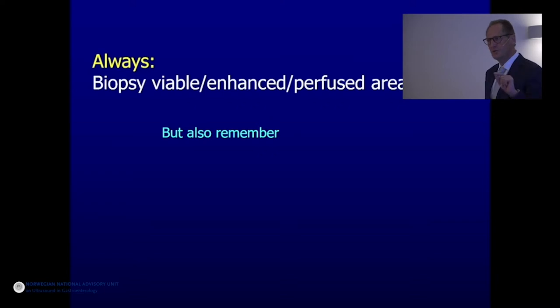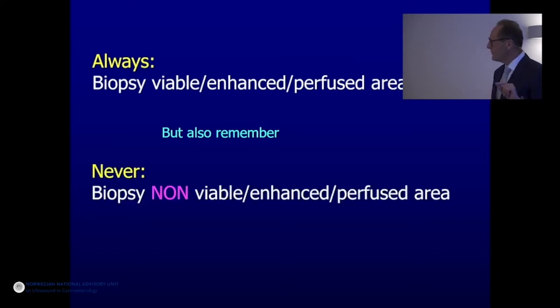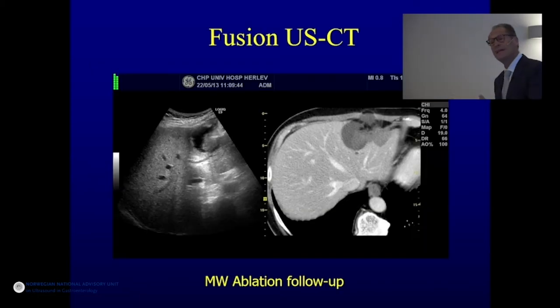Because if you don't, you get necrosis. But also remember, never, never biopsy non-viable, non-enhanced or non-perfused areas. Why would you? Because you would only get necrosis. So this is the case of the opposite.